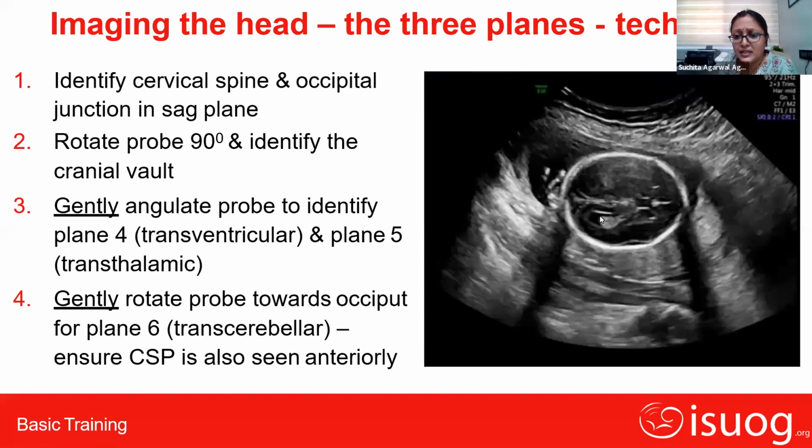Rectangular. This is a rectangular box-like structure. There's an equal to sign.